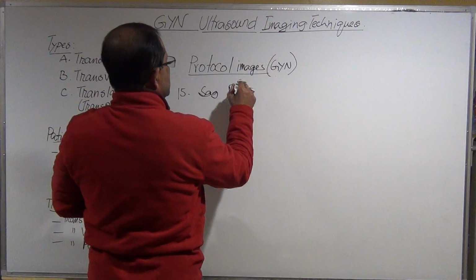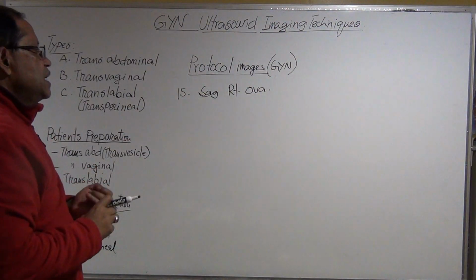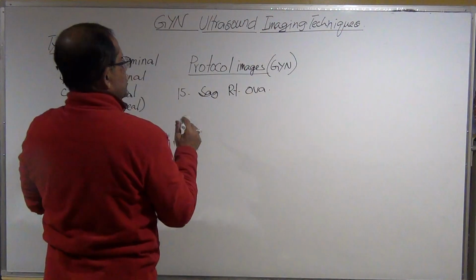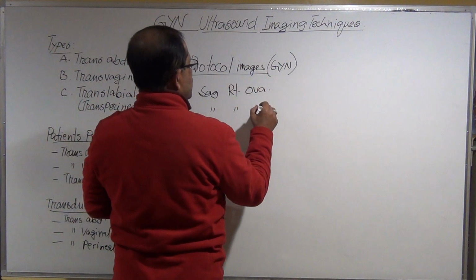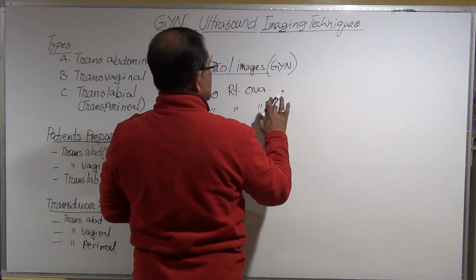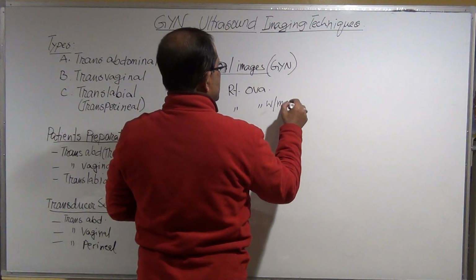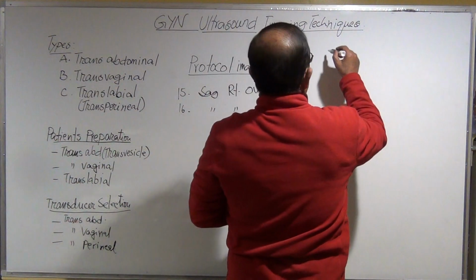It says right ovary without measurement. 16 says right ovary with measurement.